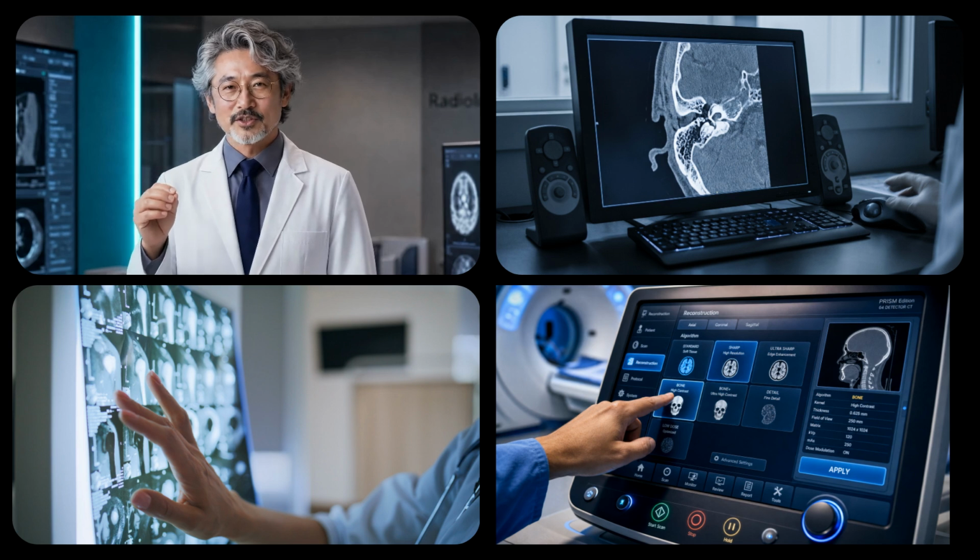Reconstruction algorithm selection directly impacts edge definition at high contrast boundaries. Technologists must apply high spatial frequency bone algorithms, sharp kernels, to resolve delicate trabecular patterns and cortical margins. While sharp kernels increase image noise, the high contrast differential between dense bone and air-filled mastoid cells produces excellent signal-to-noise ratios for diagnostic evaluations.